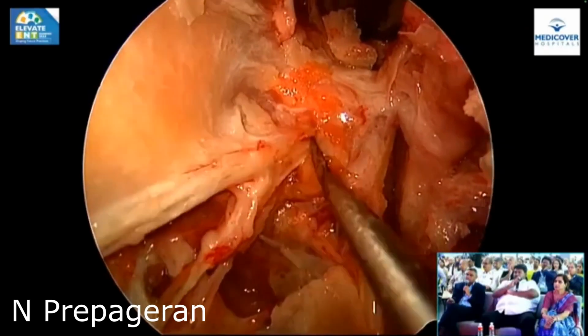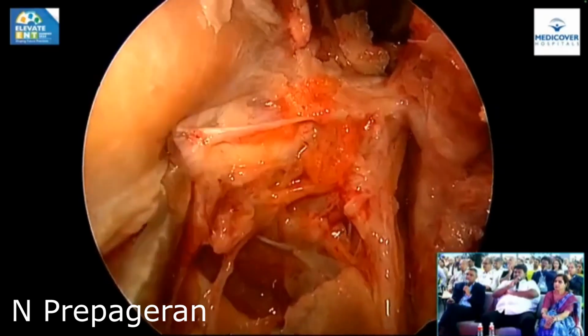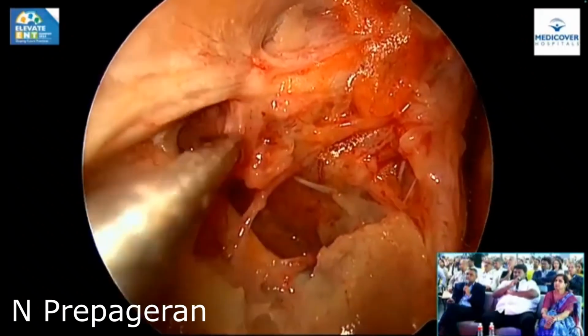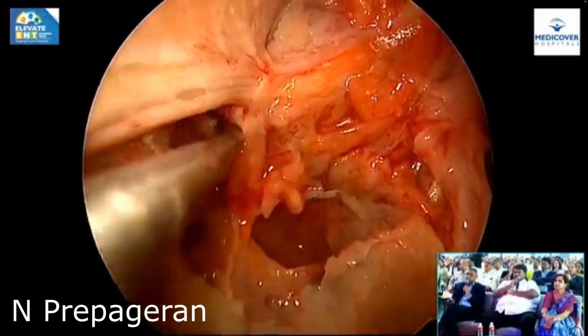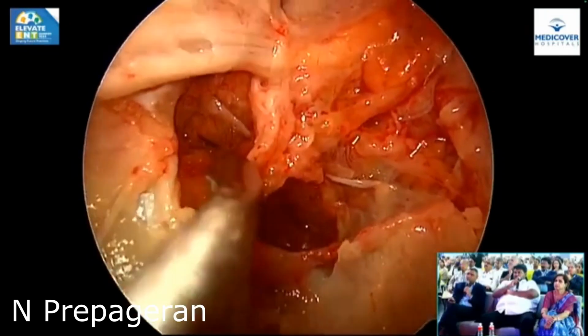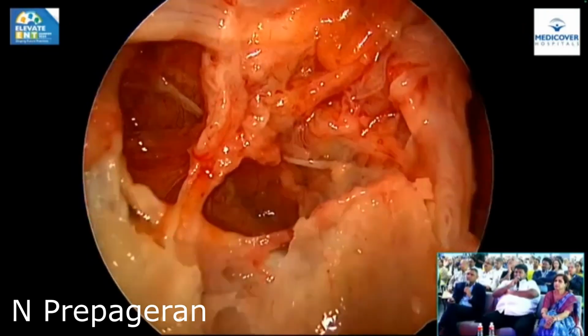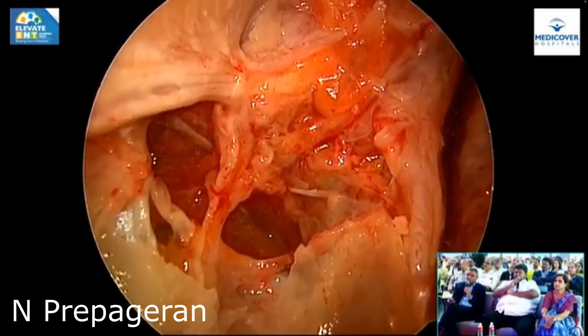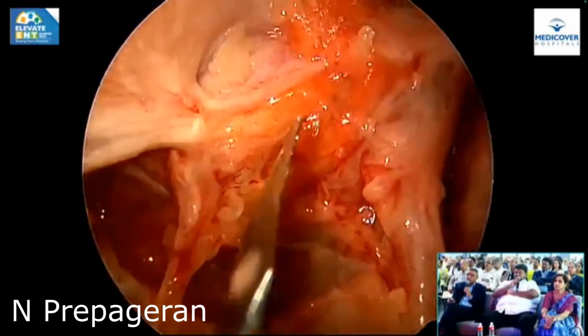Infraorbital nerve. The conductor of the orchestra. So the same way as I would do in real life surgery, sickle knife. At the back here, if you dissect, you will see the temporalis muscle. You can see the fibers. If I move, longitudinal fiber, yes. There, temporalis muscle there, and the IMAX will come between the two pterygoids here.